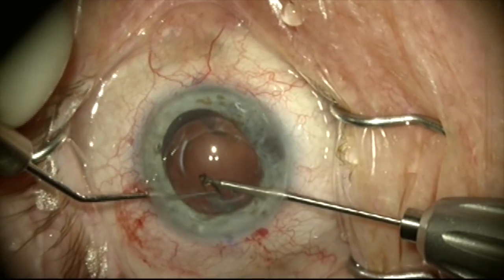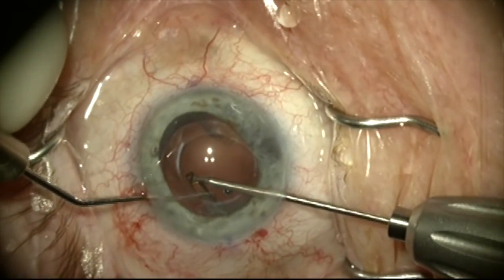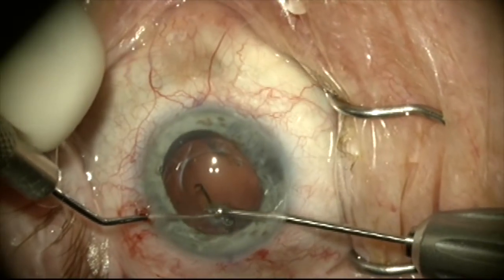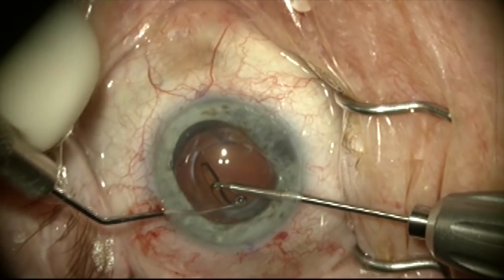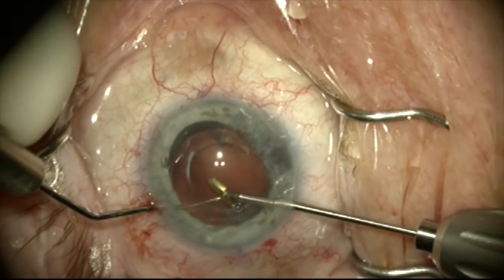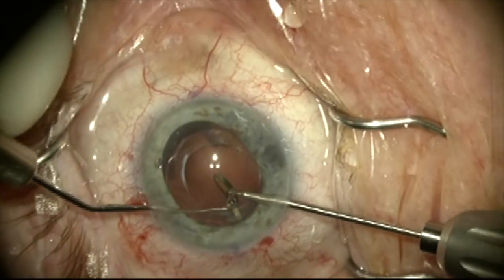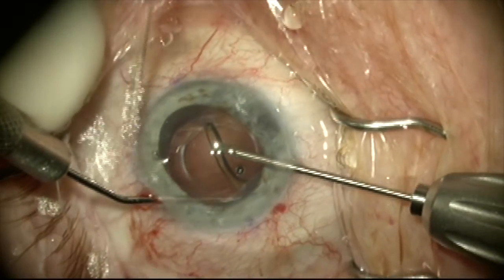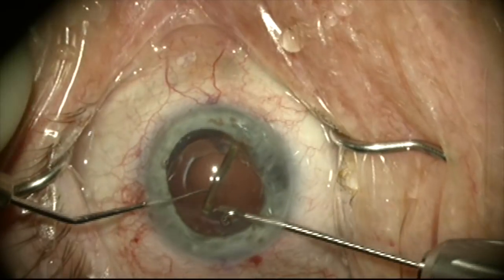Now that the rest of the lens is no longer attached to this haptic, we can get a better angle pulling this up as we sweep the fibrosis off. I can really get a good feel for how much tension I'm putting on the haptic and on the zonules so I don't do any damage — this is really something you just get a feel for. The haptic is now freed up and I can take it out through the main incision.